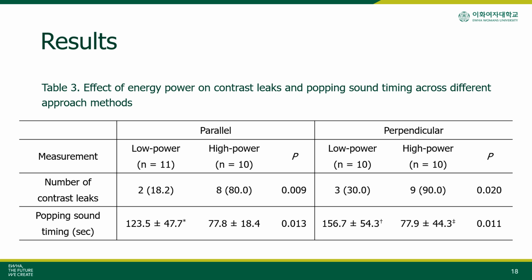This table presents the results based on the energy power for each approach. Contrast leaks were observed less in the low power protocol compared to the high power, regardless of the antenna approach. The popping sound timing was significantly delayed in the low power group, regardless of the access method.